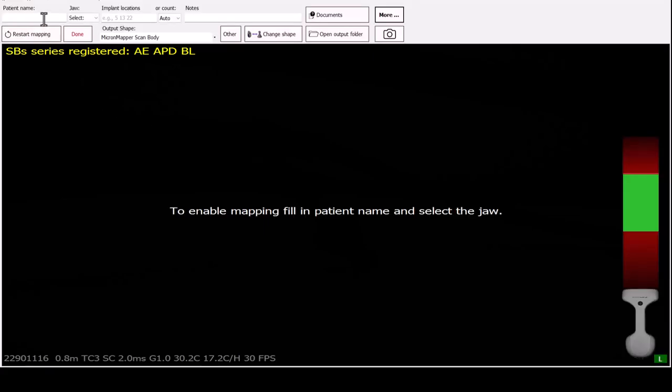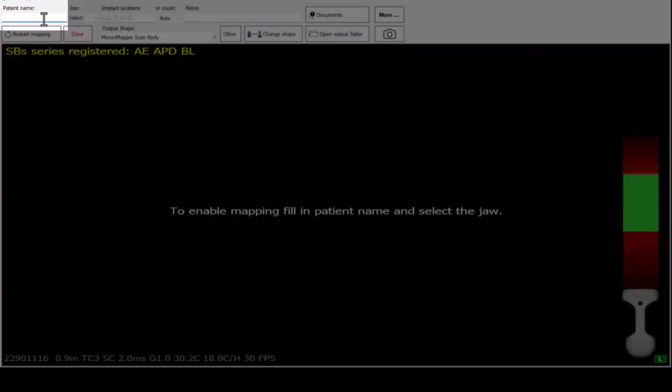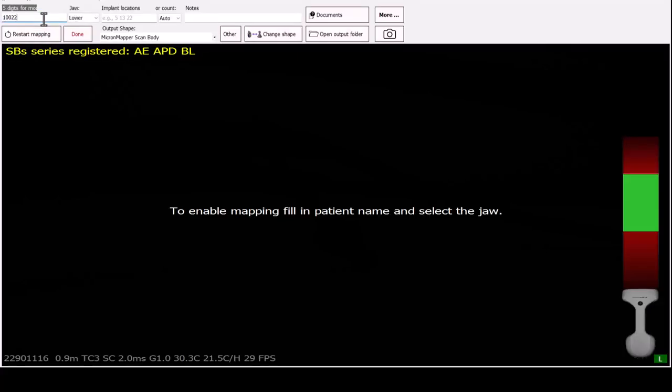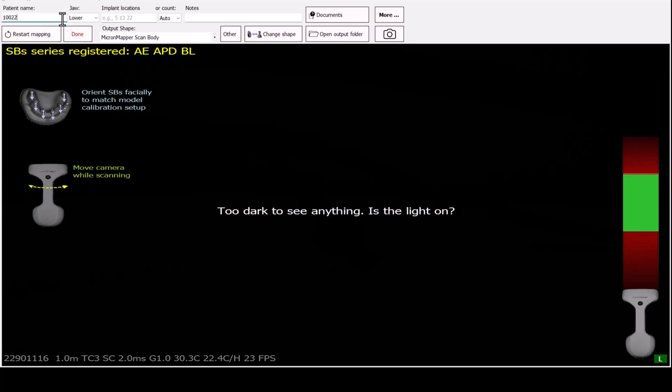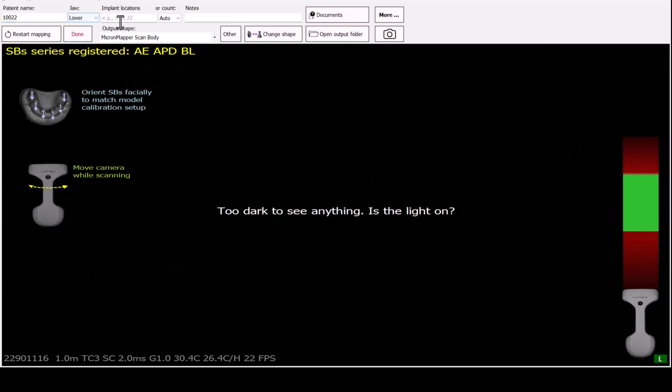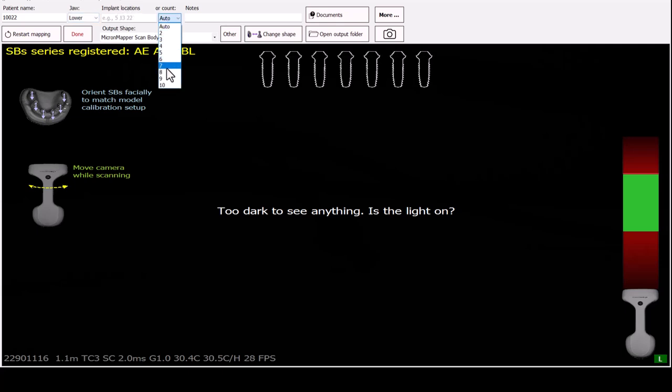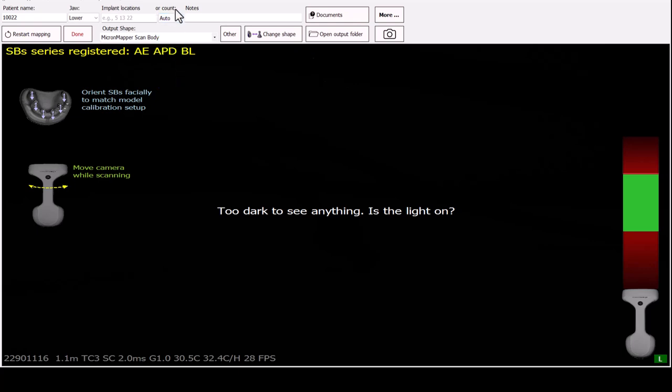To begin scanning, please enter the patient name and select the jaw that you wish to map. You can also type in the number of the stone model you have to check the accuracy of your camera. Next, you may enter implant locations or count. You can also select AutoCount, in which case MicronMapper will only map those that are in the field of view. You may add any notes in the next field.